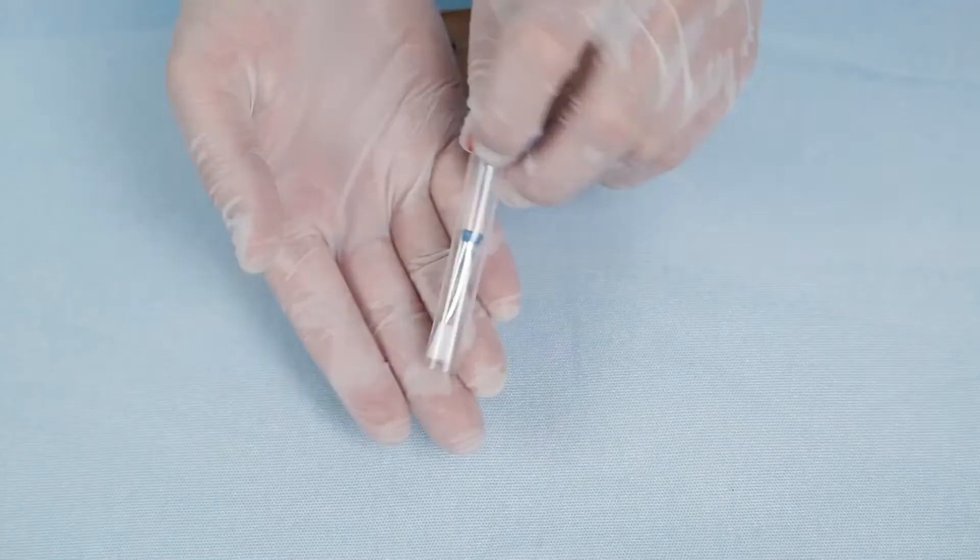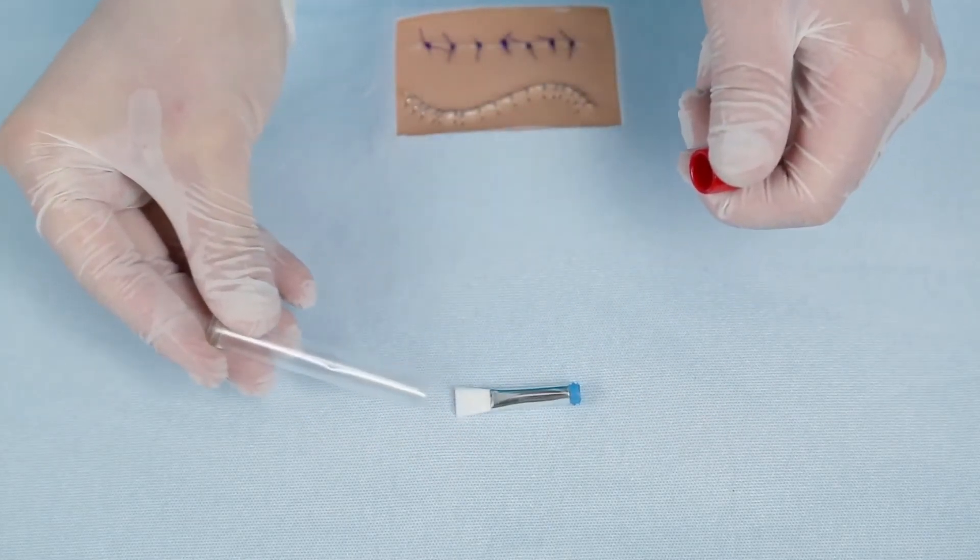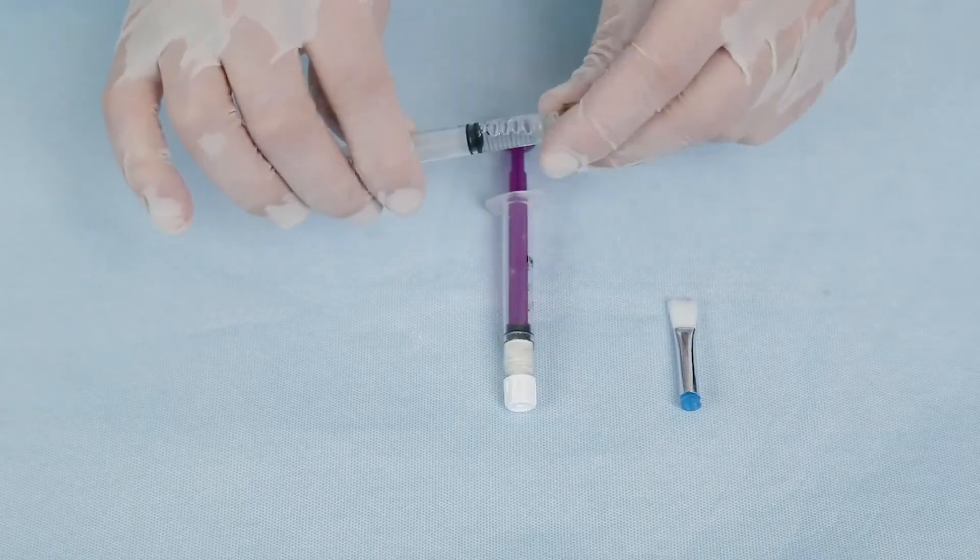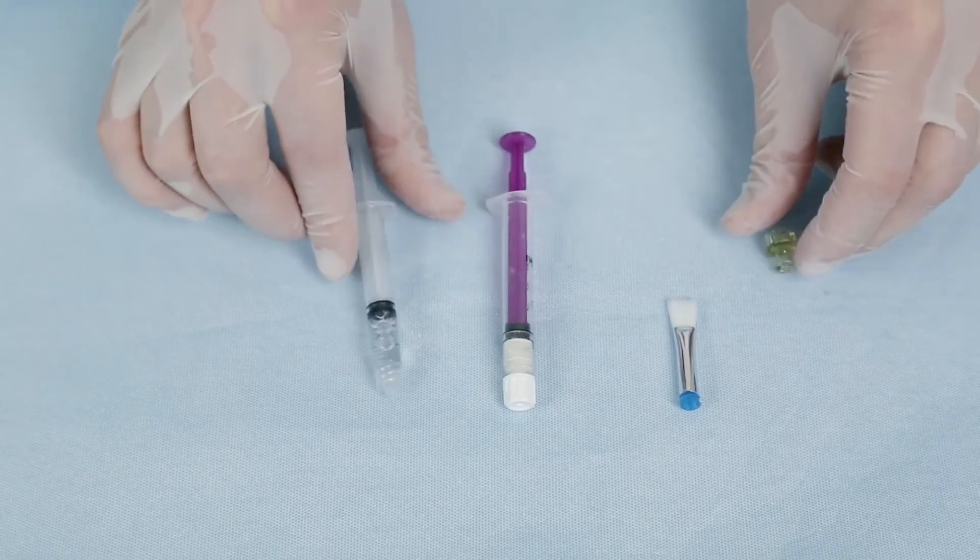Remove the sterile application brush from the brush case and have it ready for use. Remove the caps from the two syringes and connect them together.